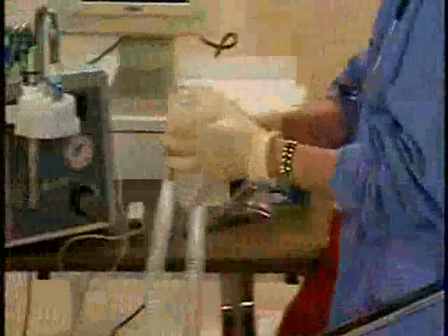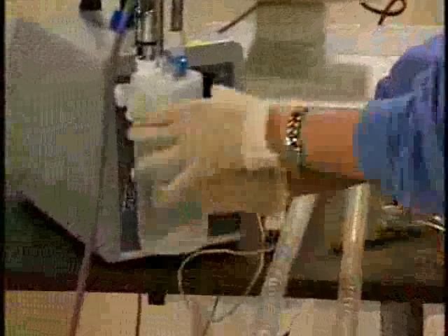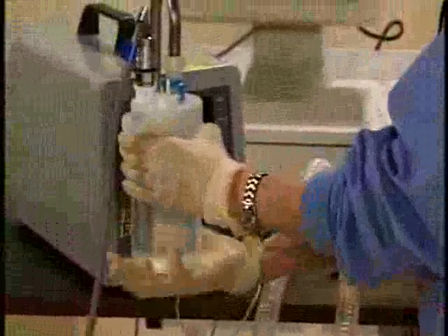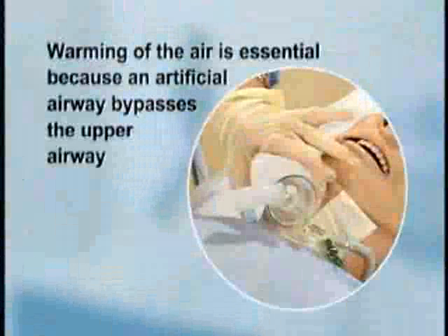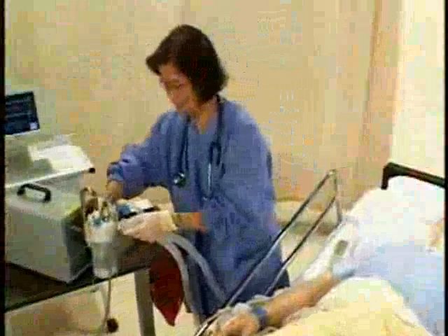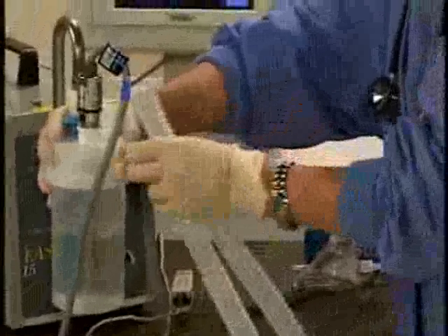Wash your hands and put on clean gloves. Next, attach the humidifier and add a warmer to the oxygen flow meter. Warming of the air is essential because an artificial airway bypasses the upper airway.